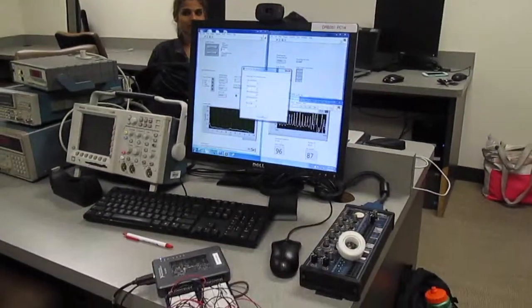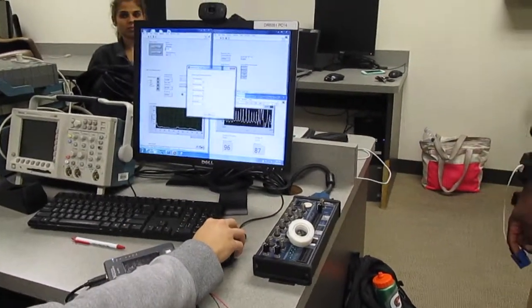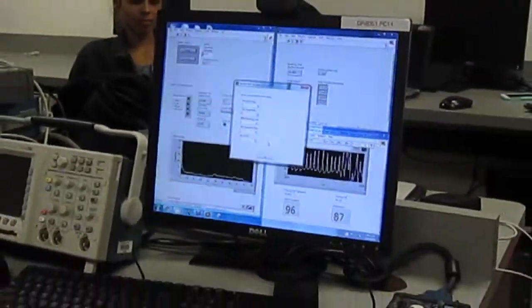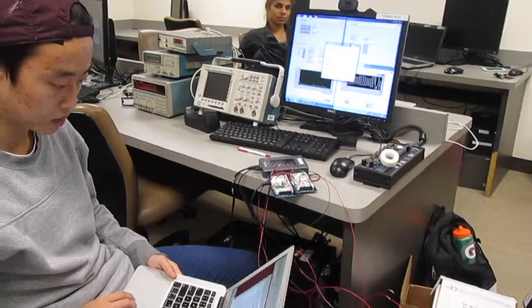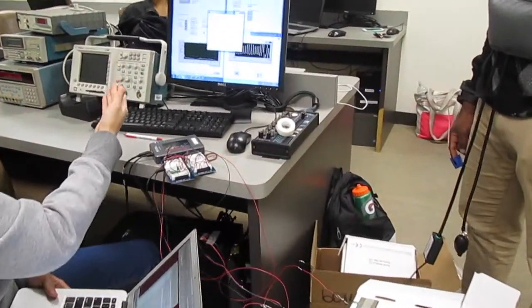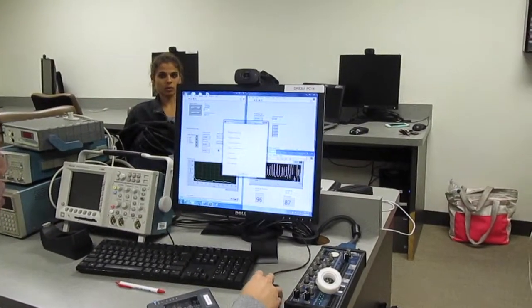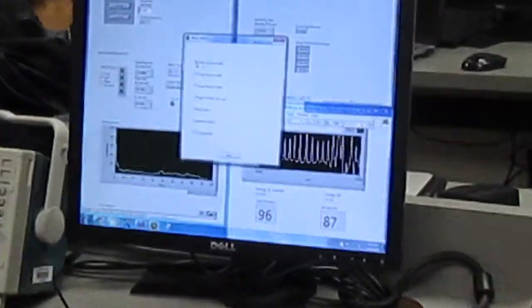If the values fall out of threshold, or if the unwanted body position is activated, the system switches to a case where it checks if the rates or positions remain at the unwanted values for the alarm threshold time. If at any time before the threshold time is met, the sensor input changes to acceptable values, the system reverts to the checking for match stage from before. If the sensor inputs, on the other hand, stay at the unacceptable values, then the system moves to an alarm stage at which the time dialog box pops up.